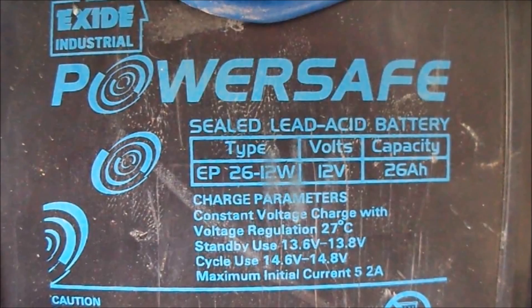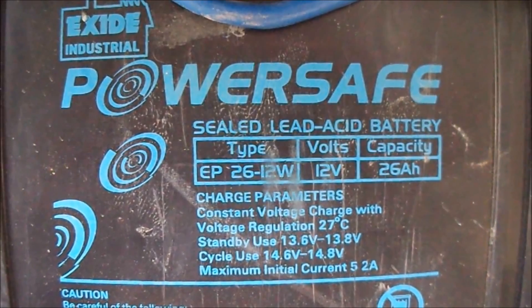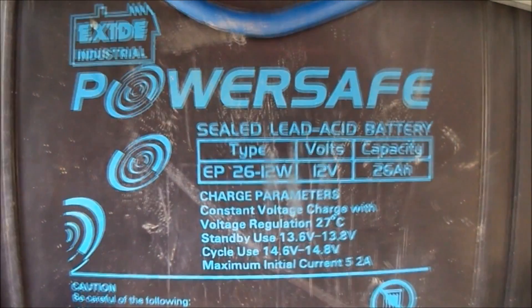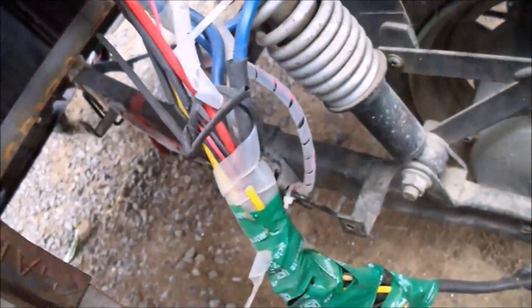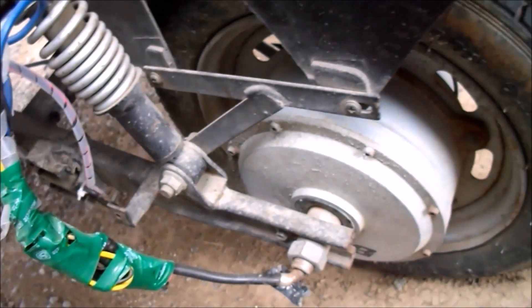Our vehicle is powered by four batteries. These are lead acid chemical energy stored batteries of 12 volts and 26 ampere hours. The four batteries are connected in series to form a terminal voltage of 48 volts, which provides sufficient voltage to drive the BLDC motor. These batteries are rechargeable.